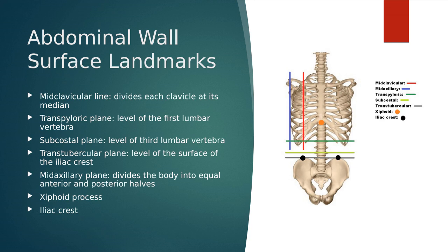They're also something that we are able to palpate, so we can actually feel that iliac crest on most of our patients. That's going to be the indicator of, are we doing an abdominal exam or are we doing a pelvic exam? Anything below that line, we're going to be doing a pelvic exam. Anything above that line, we're probably going to be doing an abdominal exam.